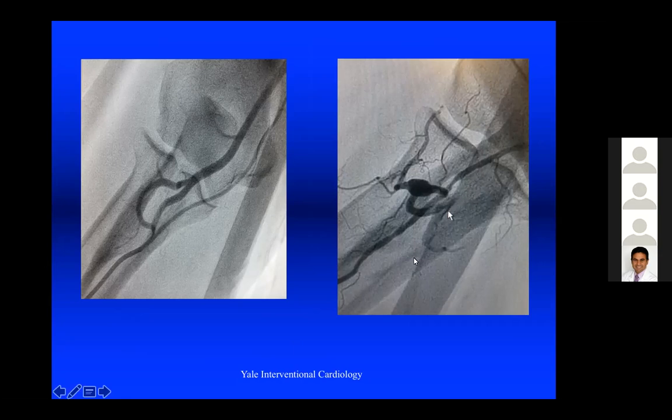And then this is the ulnar artery. The radial comes up here and then continues up to connect up high in the shoulder. But this is a 360-degree circle here between the radial and the ulnar. And that can be difficult to navigate and to get around and to straighten out. And very often, if I see this kind of a connection, then I'll either move to ulnar access or femoral access, because that's difficult for you and can be very painful for the patient.